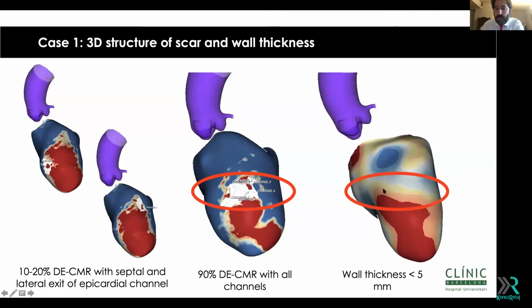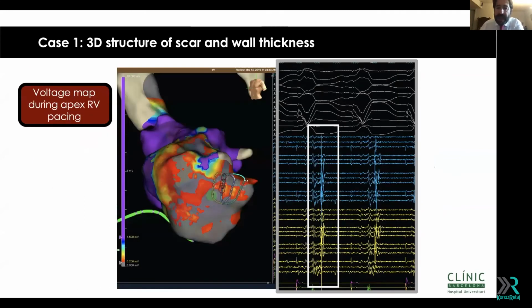And what did we see in the endo? Look at this HD grid voltage map with clear scar and a voltage channel in the middle of the scar. It was pretty much the area where the MRI showed us, with late potentials clearly seen.